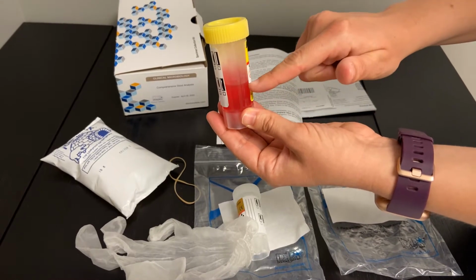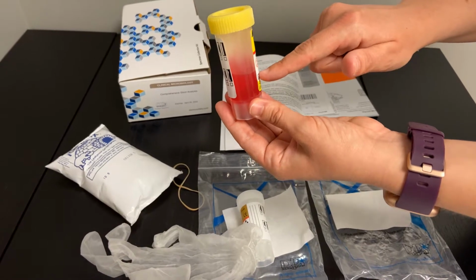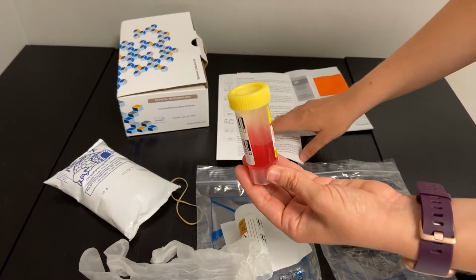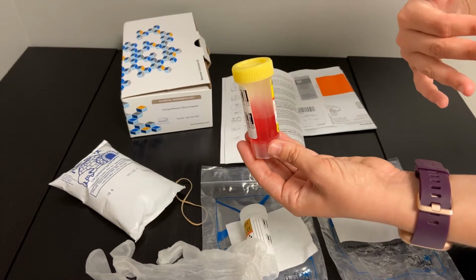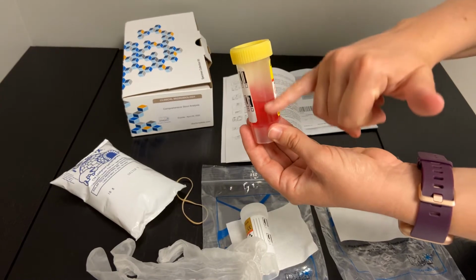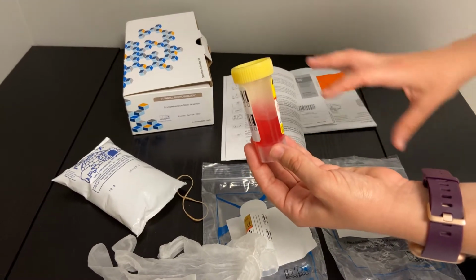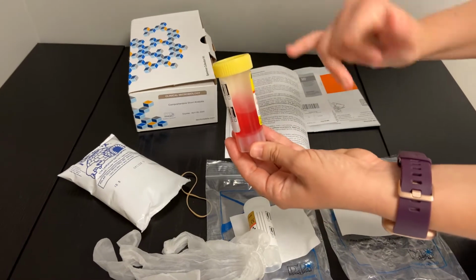If you notice that this liquid is anything below that midpoint level of the vial, or there's any kind of wetness around this vial when you receive it, please contact the company with the information that's included on the front side of this packet to let them know, and then they can supply you with an additional vial. If anything is sent to the company with less of this liquid in here, they can't process the sample, and we want to make sure that you only have to collect just the one time for this test kit. So it's important to do things right, of course.